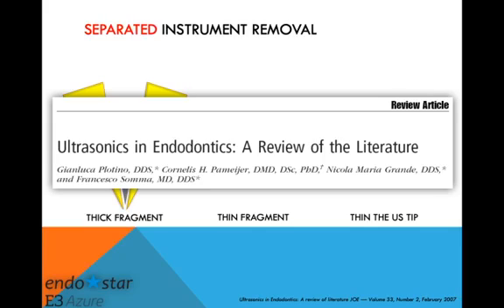Now, moving on to separated instrument removal. Whenever a case is referred to me for removal of a separated instrument, ultrasonics is always an integral part of my procedure. Yes, practically I would be using ultrasonics almost 99% of the time.